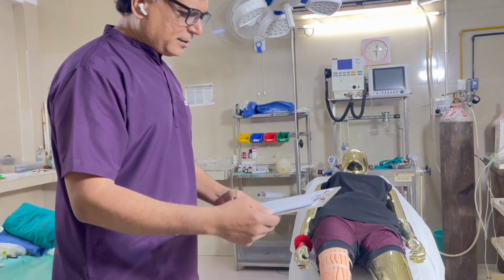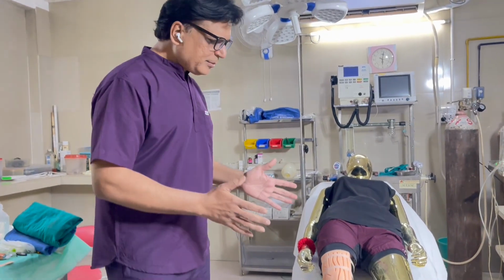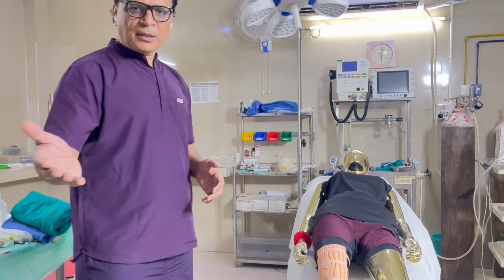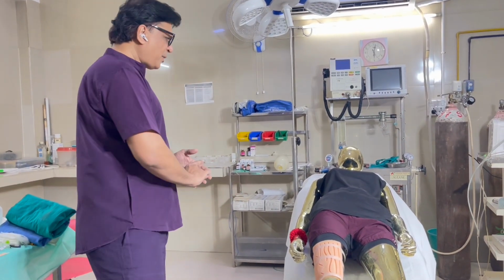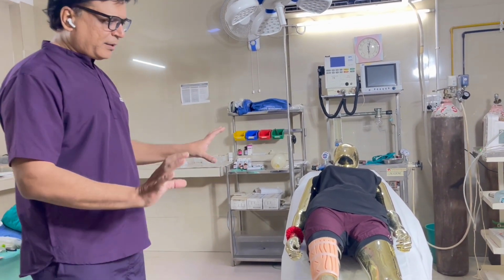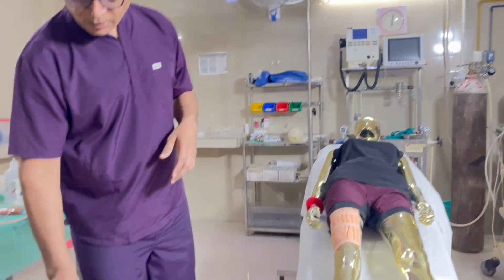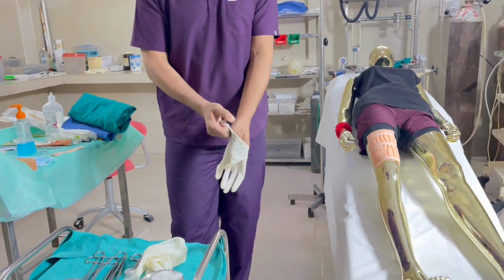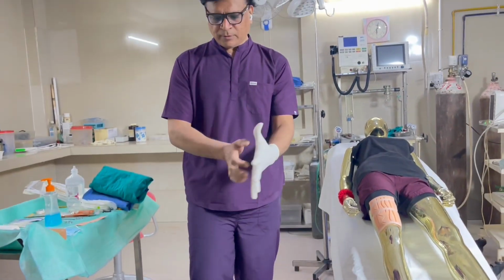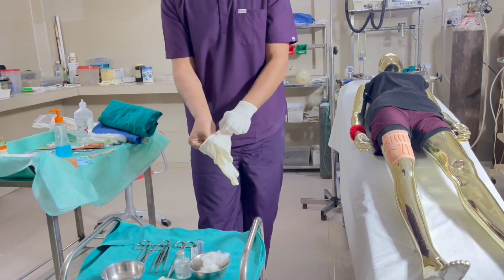So I will just check, is it your signature? Okay, thank you. Then I will be checking the WHO checklist. Is it available? So the side, right side, the wristband, the name, this patient, everything is confirmed. So I will be just preparing my trolley. So when I turn towards this, I find the gloves, then put on the gloves. Again, after sterilizing my hands, I put on the gloves.